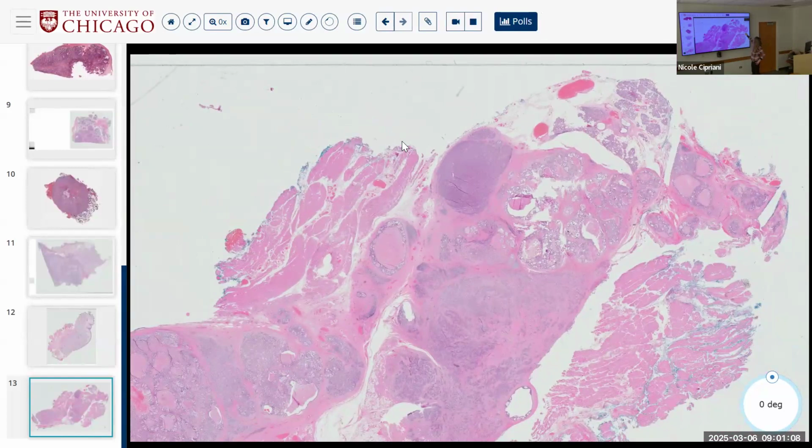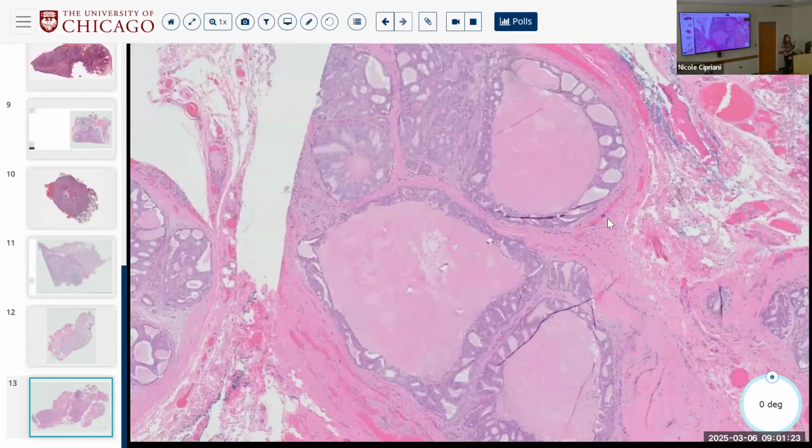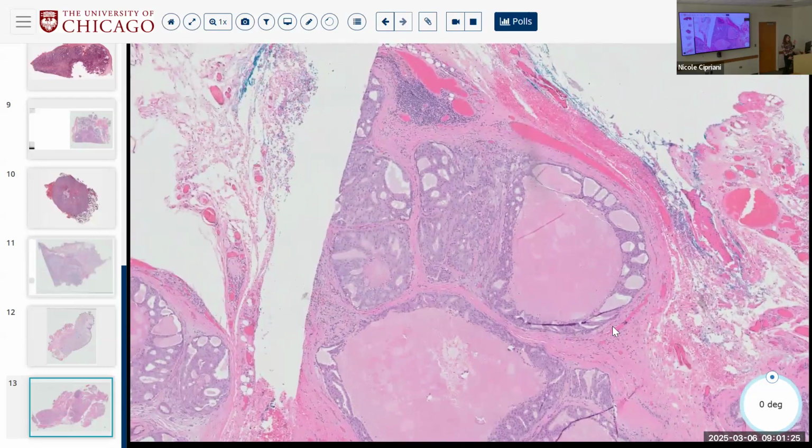Remember that most of these are infiltrative. If you were to throw a P40, this would just be dead negative. However, in some examples of salivary duct, you can have P40 lining the periphery of these large nests with other areas that are infiltrated, implying that there's some kind of intraductal spread, almost like DCIS, right?